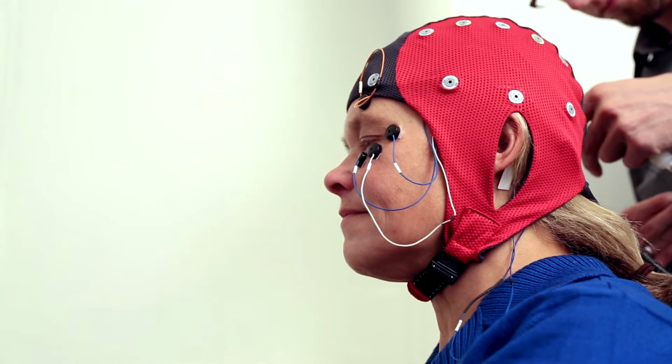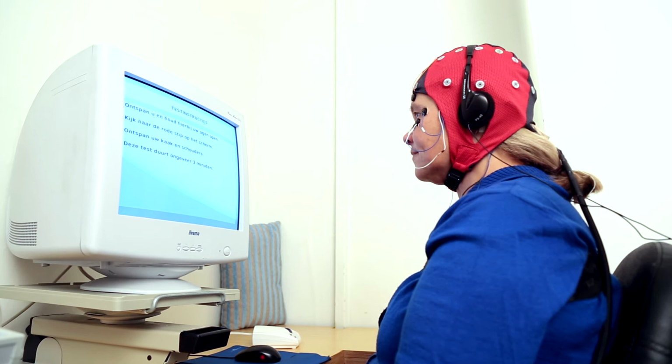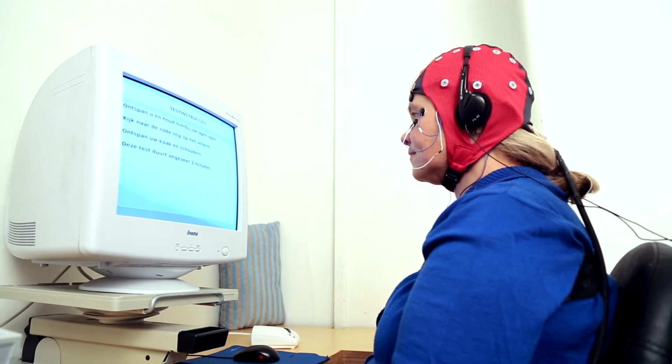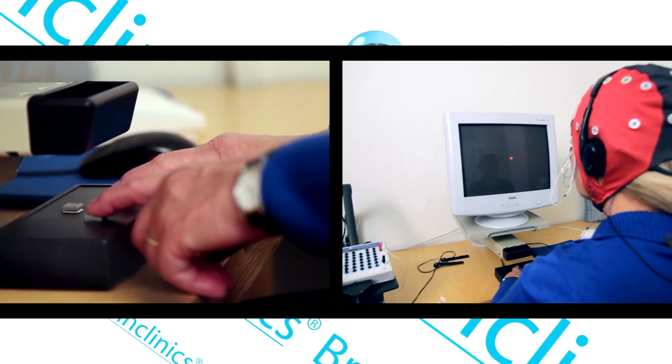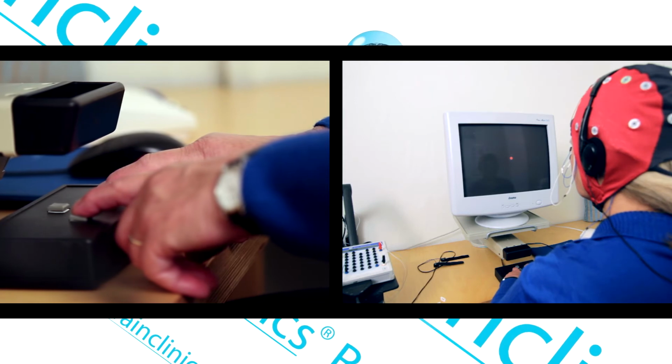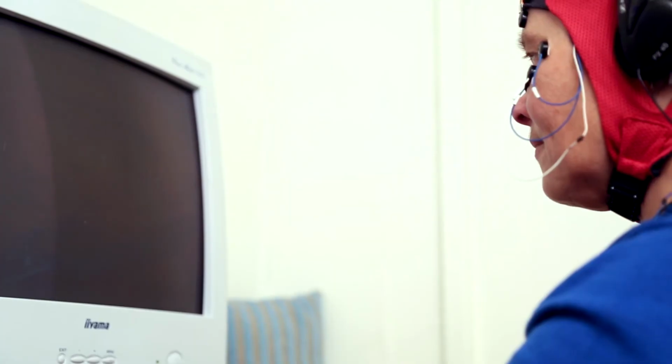When everything is properly connected, the QEEG assessment begins. For different tests, the client receives instructions via the computer screen and headphones. The whole QEEG assessment takes about an hour, and the client is asked to complete several tests using a button box. During the assessment, it is very important that the client remain relaxed and comfortable. Muscle activity and stress can interfere with the EEG signal.